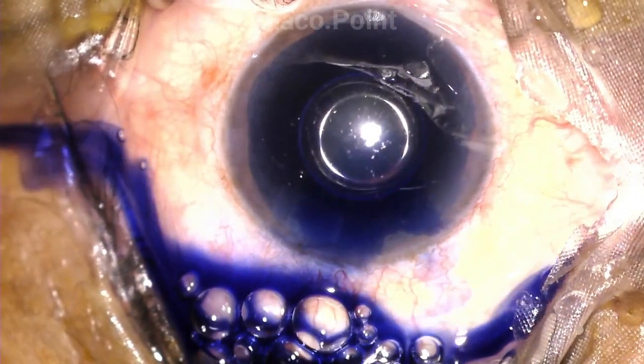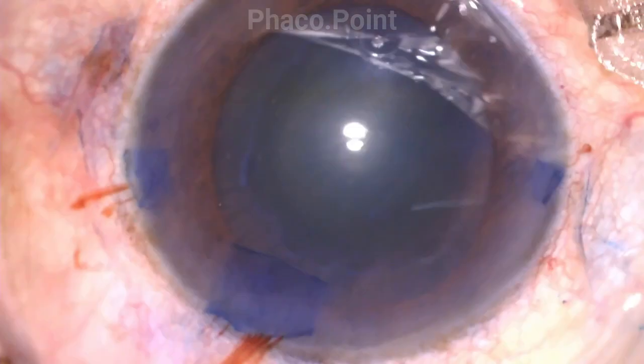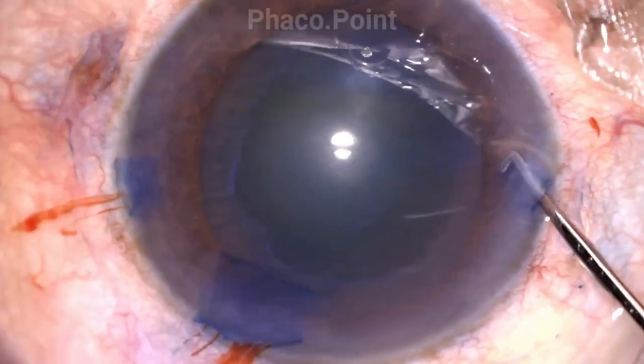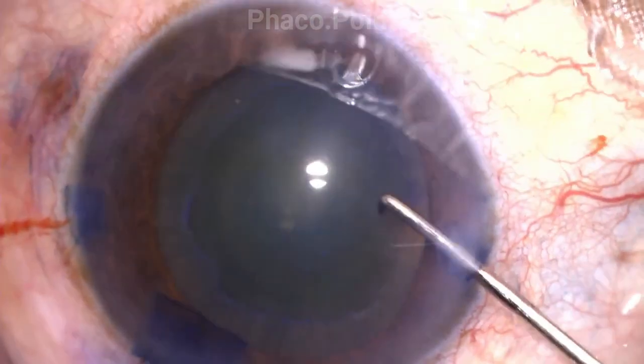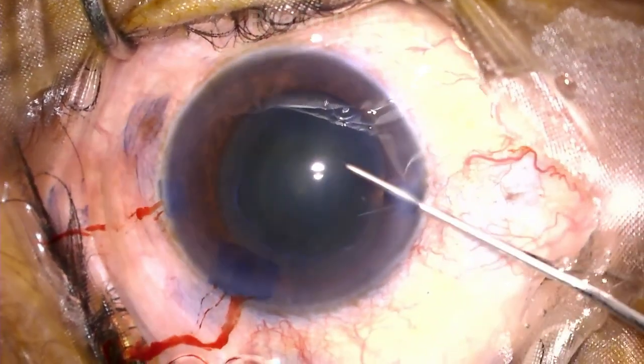Blue dye staining of the anterior capsule also results in staining of the incisions, giving us a better look at the size of the three incisions created. The one on the left, used only for irrigation aspiration, is larger. The one on the right, used for the chopper or dialer, is currently much tinier and perfectly sized to allow ease of entry and movement of the second instrument. The dialer and choppers of different lengths can most easily and comfortably move in and out of the eye without any struggle.